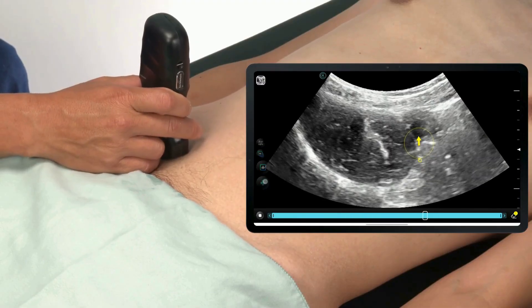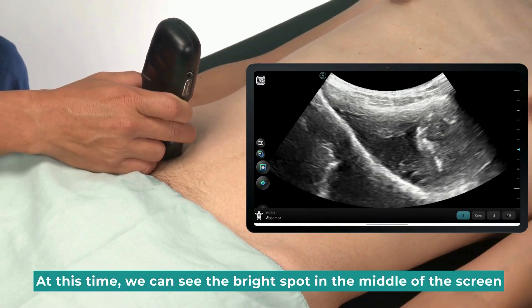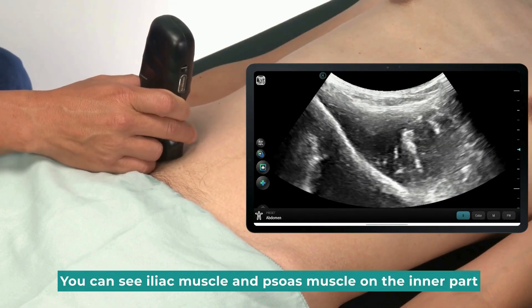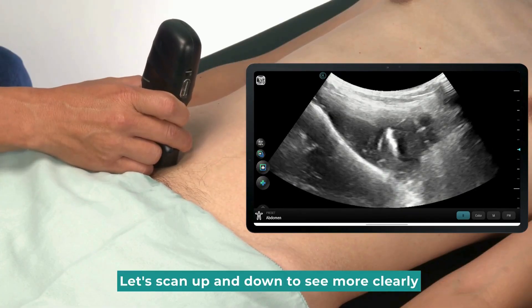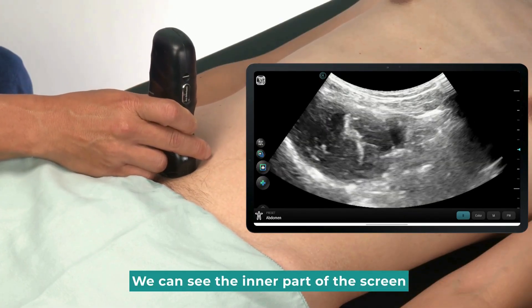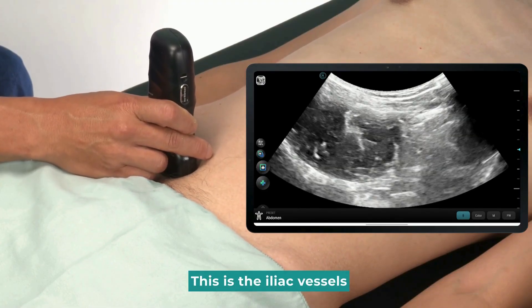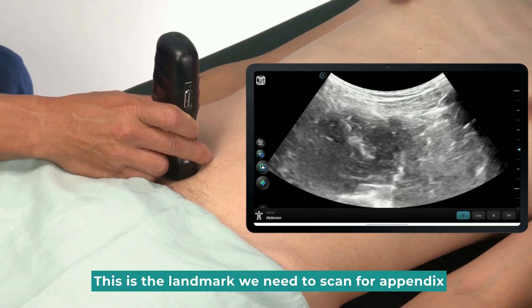Let's place the probe horizontally. At this time, we can see the bright spot in the middle of the screen — this is the iliac bone. You can see the iliac muscle and psoas muscle on the inner part. Let's scan up and down to see more clearly. The middle part of the screen is a blood vessel structure — this is the iliac vessels. This is the landmark we need to scan for the appendix.